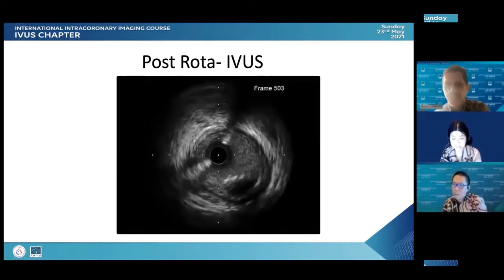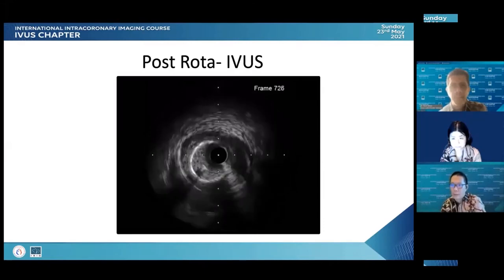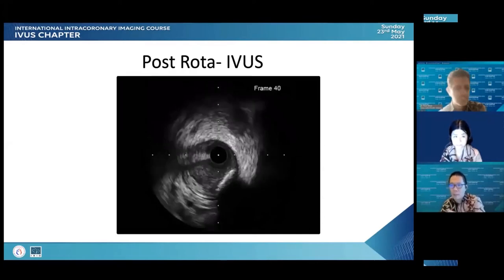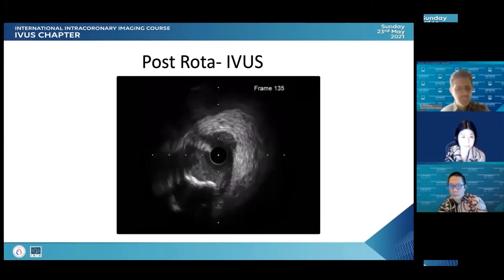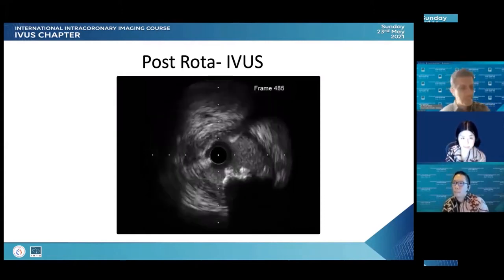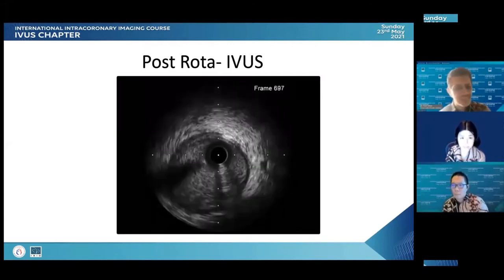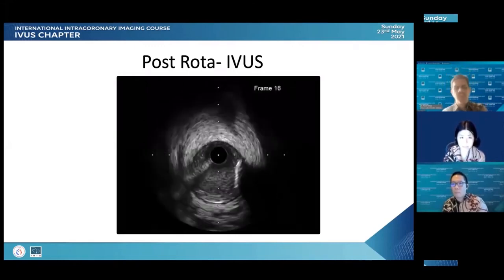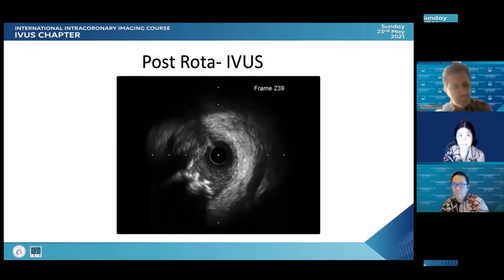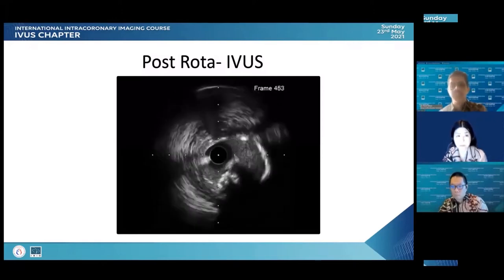Dr. Akiko, may I ask you a question? You mentioned the reverberation and the calcium crack on the IVUS finding. Do you think that reverberation alone is enough for putting the stent on, or should we proceed with another balloon dilatation? I think the answer is no, because reverberation really just means you polished the surface. It's not indicating calcium fracture. But when we look at the sequence on IVUS and OCT, typically calcium fracture occurs at the site of the reverberation, because I believe the surface of the calcium is the hardest. When you polish the surface, you have more chance to make a calcium fracture. But for a very severely calcified lesion, you should see the fracture before stenting. That really secures the stent expansion. That's my opinion.